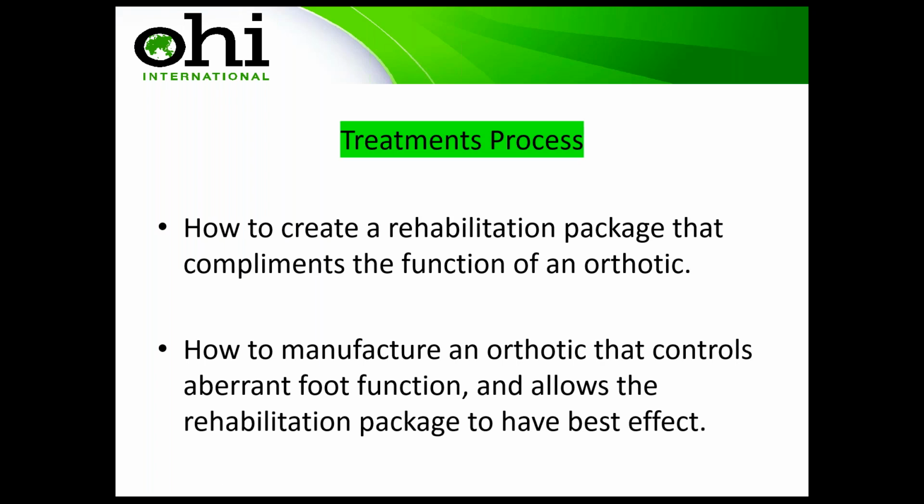Because most of these people will ask, if you send them this scan, what you do is you go to report, you click print PDF, and you send this scan to every patient you scan. You send them the report, it goes onto their phone, they go out for lunch, they go out at the weekend, they're playing golf and they're showing it to their buddies. And they love doing it because everybody loves to compare notes, how bad their foot is. And that's a really good marketing tool for you.